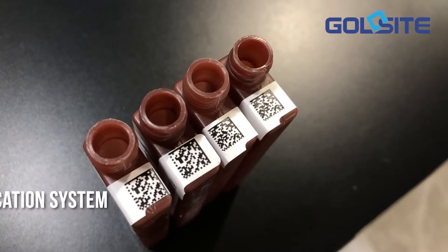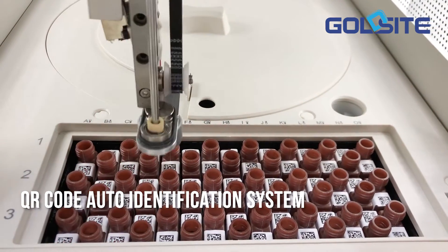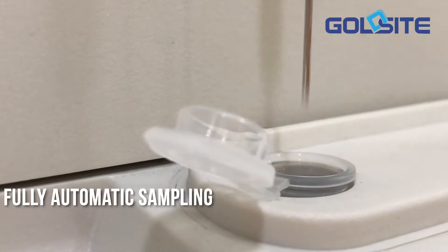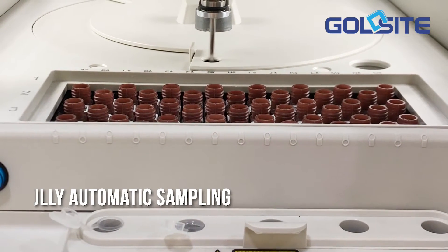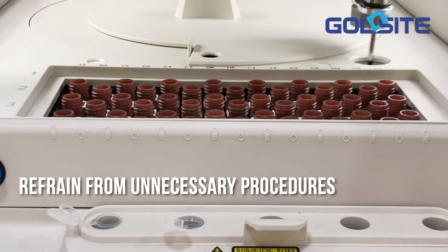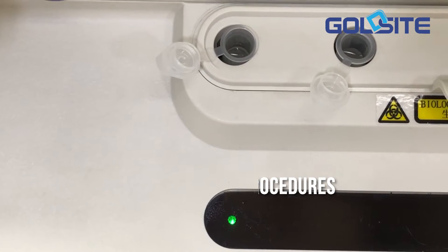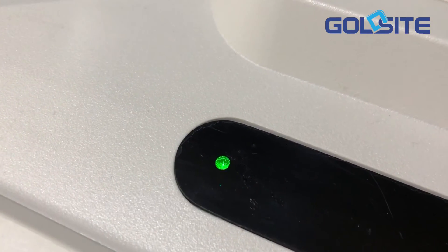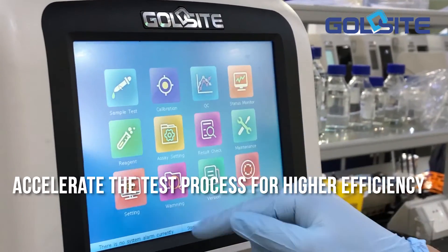QR code auto-identification system. Fully automatic sampling — all hands-free processes help you refrain from unnecessary complex procedures. After sampling, respective green smart indicator lights turn on as a signal to add new assays, which accelerates the test process for higher efficiency.